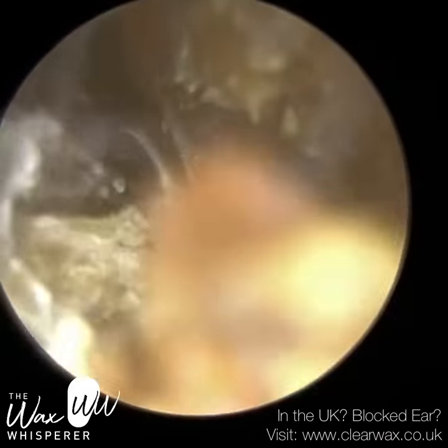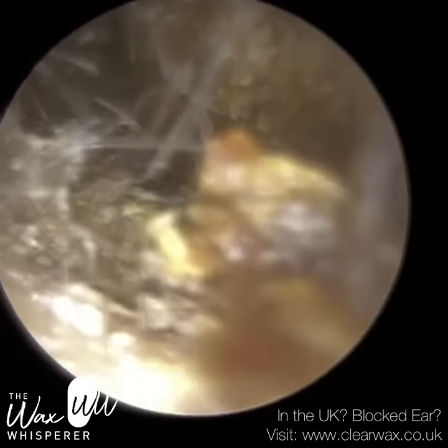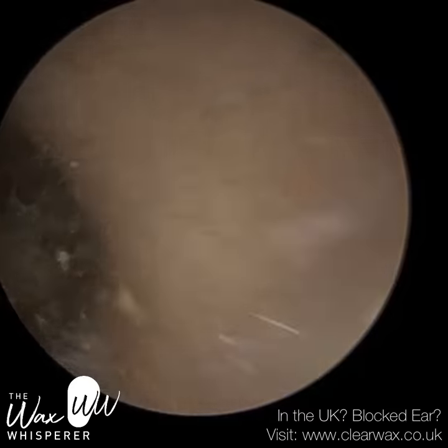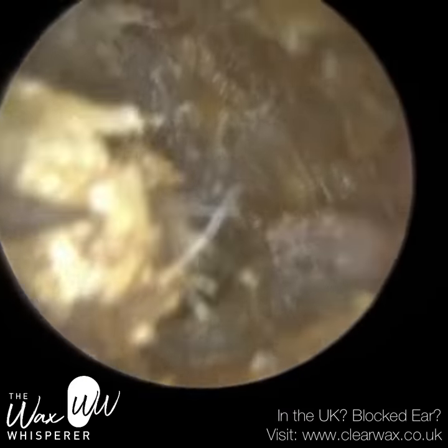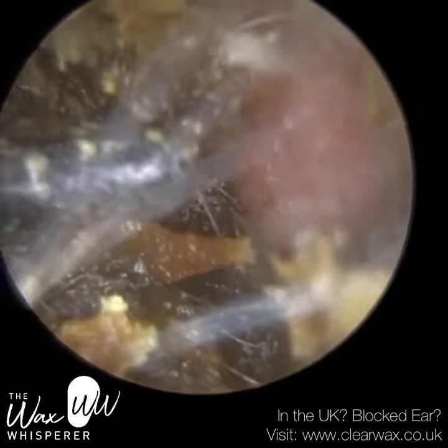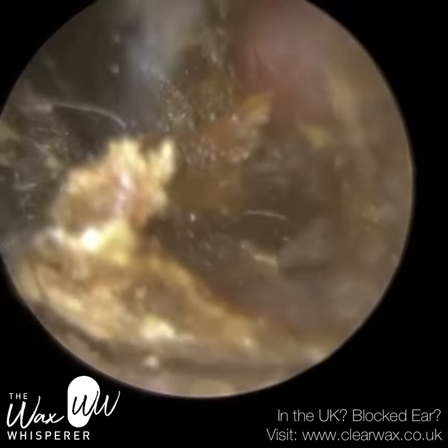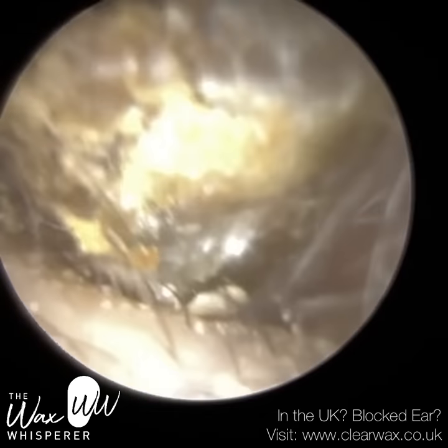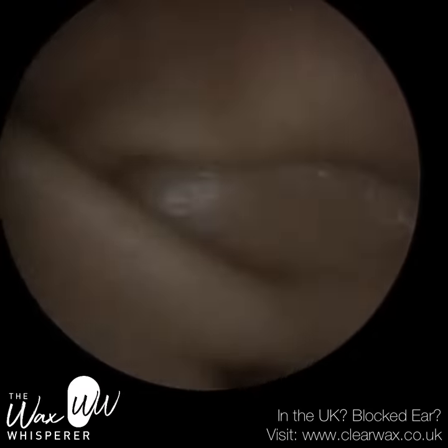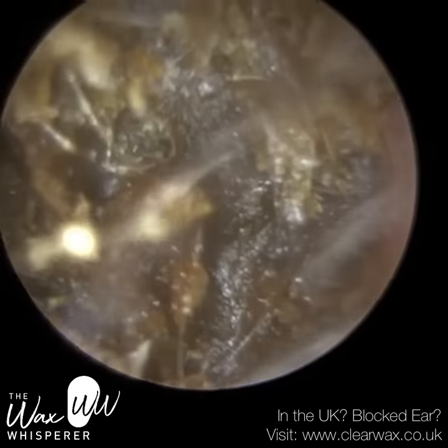I'm going to rotate the hook clockwise 90 degrees and try to remove this off the anterior canal. In an ideal world, every time I embed the tip of the hook into the wax core, I'm hoping the entire wax block comes out. But as you can see, it doesn't — it's quite a crumbly consistency.